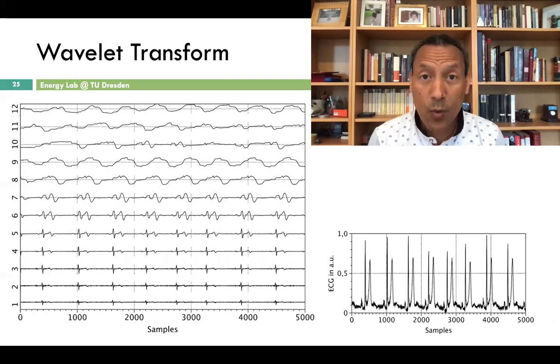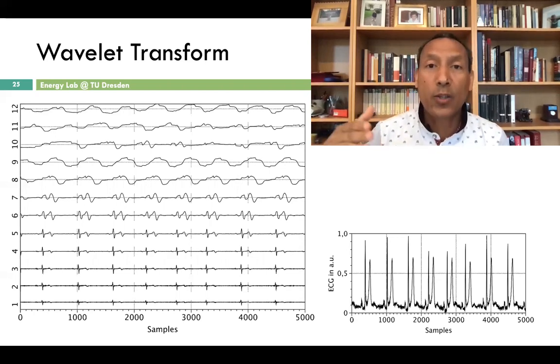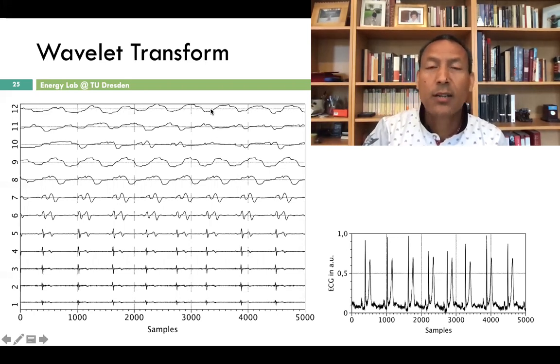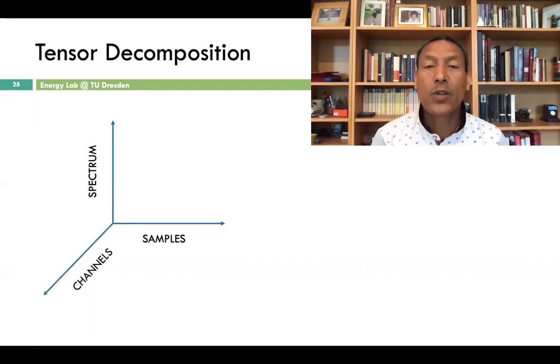So this is only for one channel. Now this is, for example, for left leg, left arm. If we want to have the same thing for left leg, right arm, then we have an additional two-dimensional data. For the accelerometer, we have an additional data. For the gyroscope, we have an additional data. That means we are now dealing here with three-dimensional data.